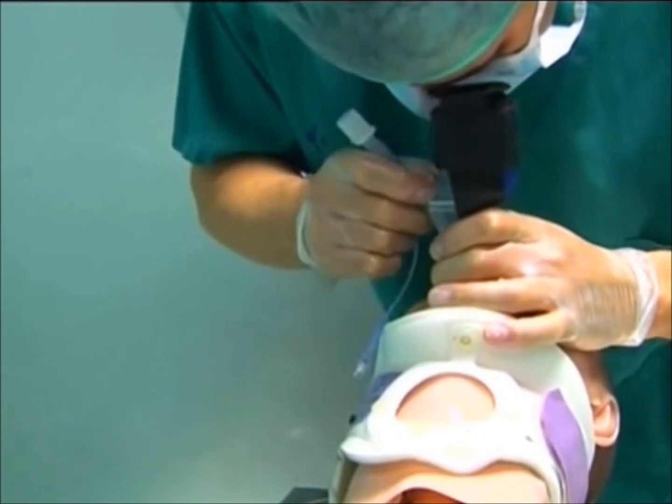If the tube hits any tissue or tends to go to the oesophagus, withdraw the air-track by rotating back and lifting it up so it's not too close to the glottis. Introducing it too deep can make inserting the tube difficult.